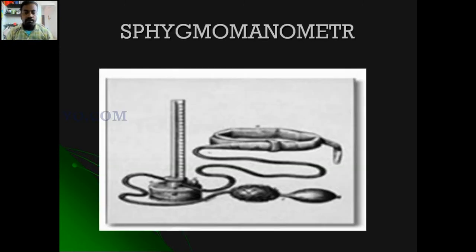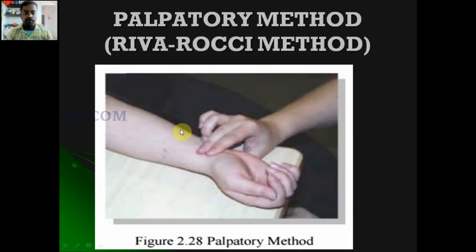Okay, right. So this is a manometer. Actually, here we are using the very smaller lean cuff. This is an air source, that is a bulb. Here this is a mercury meter, and this is a mercury scale, where we can measure the mercury levels.